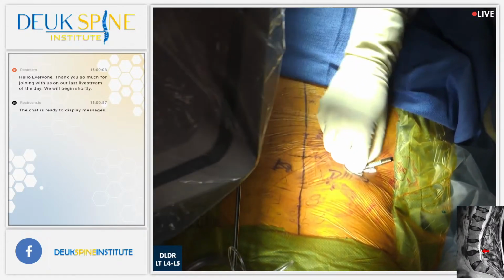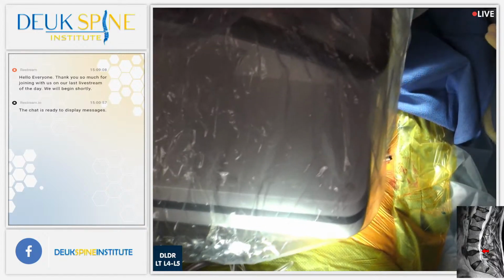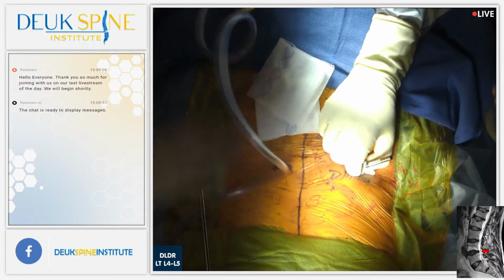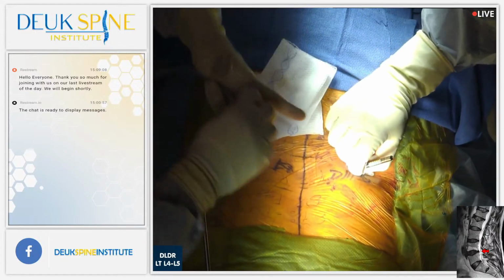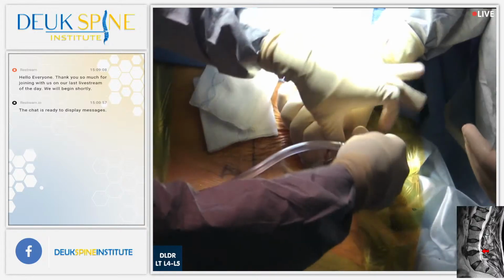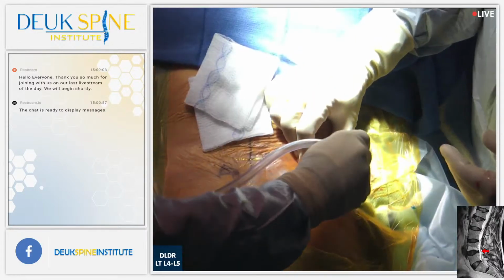He seems to be on some type of medication or supplement that is making him bleed a little bit. It's not much, it's just a little bit, but it does have an antiplatelet effect that is impairing his platelet function. It's not bad, it's very mild.